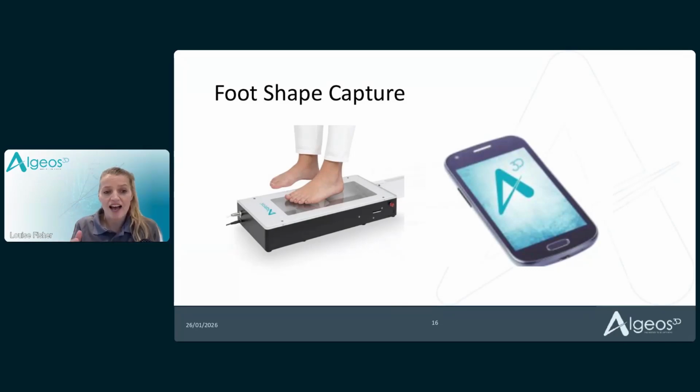You'll generally have a narrower heel and a narrower foot width than you would if you were semi or total weight bearing. If you're trying to control a foot and stabilizing a foot, then a weight bearing impression may not be the best technique if the foot collapses under load or it isn't going to function the way you wish under load. You may want to control that capture so that can replicate into your device.